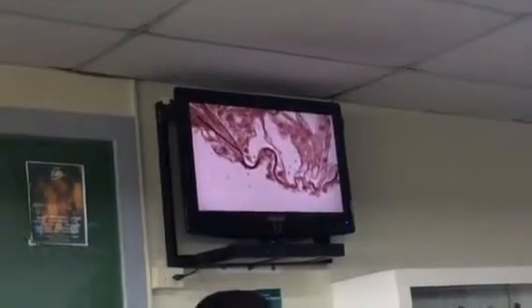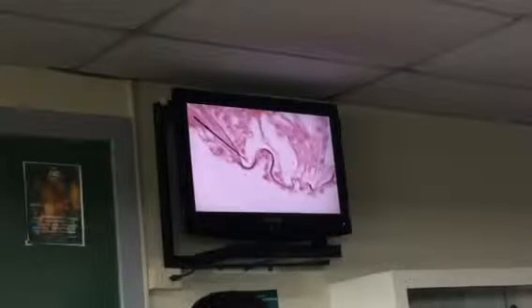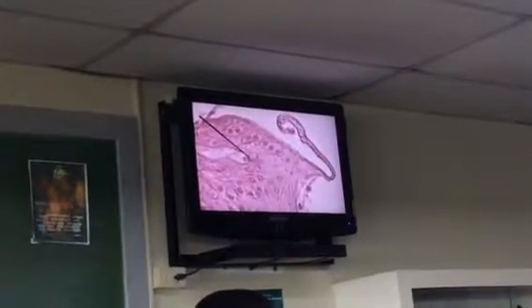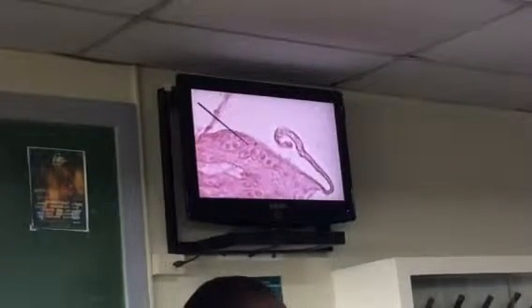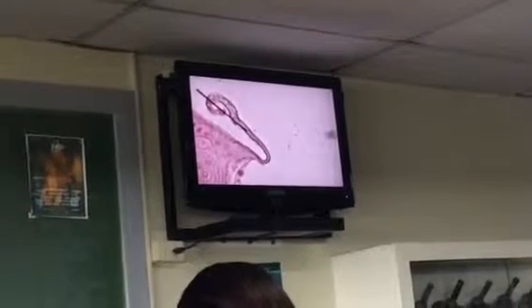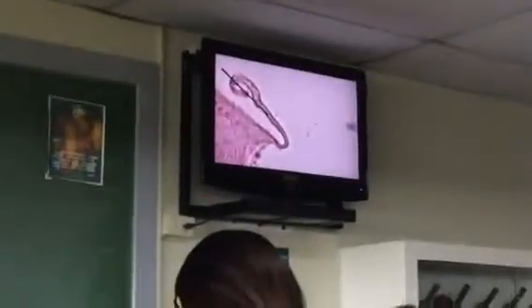So again, this is your organ of Corti. This now is what we call the spiral limbus. It has cells called interdental cells. That one is responsible for the production of this membrane, what we call your tectorial membrane. So the interdental cells produce secretion, produce your tectorial membrane.